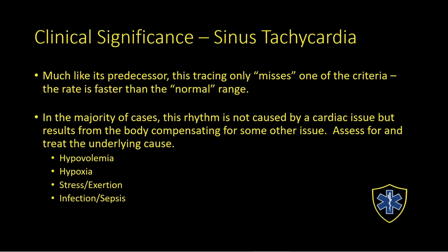Infection or sepsis, we can start treating that. A lot of times, one of the early presentations of that will not only be elevated heart rate, but also concurrent hypovolemia. Any of these things can cause sinus tachycardia. If we think back to the beginning when we were learning about shock, one of the first things our body does to compensate for shock is elevate the heart rate to make it work a little bit faster. So this is showing signs of that elevated heart rate.